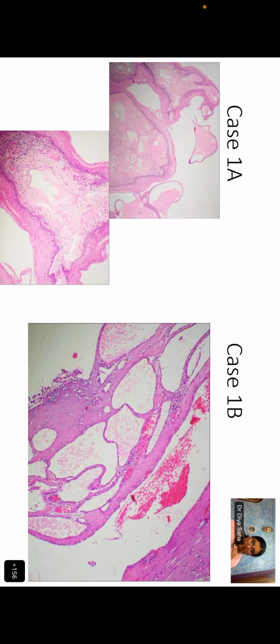I see. Okay, Sweta, now you've heard both Vimi as well as Dia. So now do you agree with both of them, or you disagree with either of them? I don't think it is a secretion, ma'am. It is just an eosinophilic material. So now let us come to a discussion of what is a secretion.